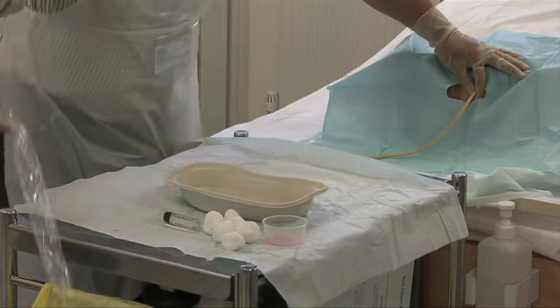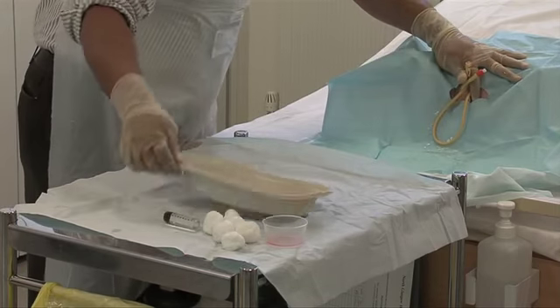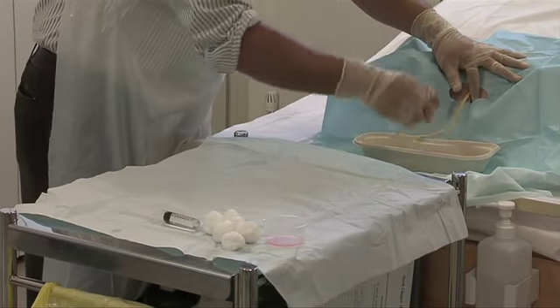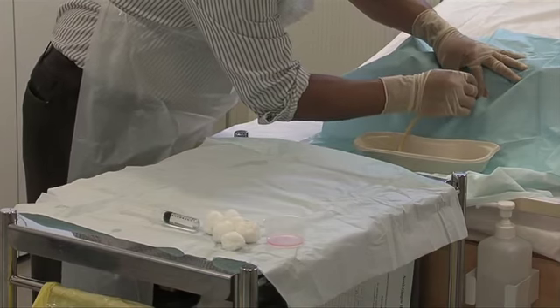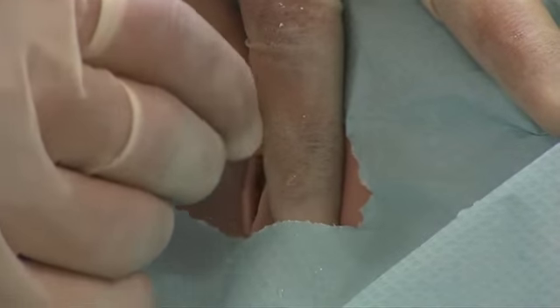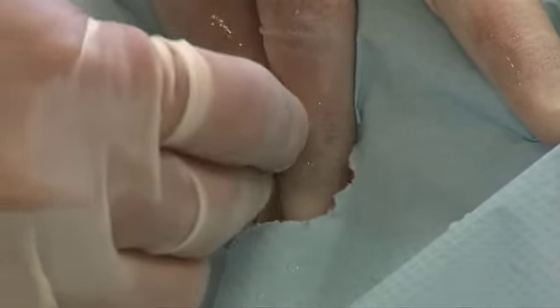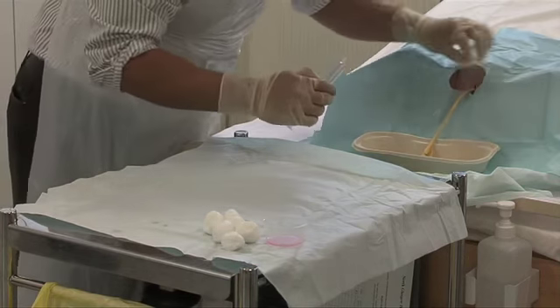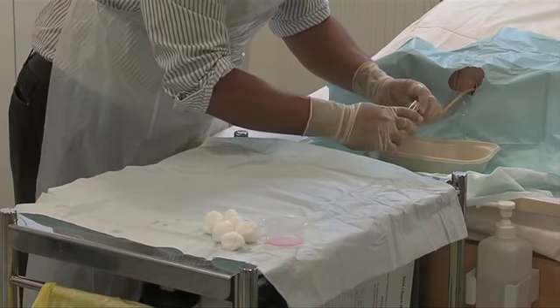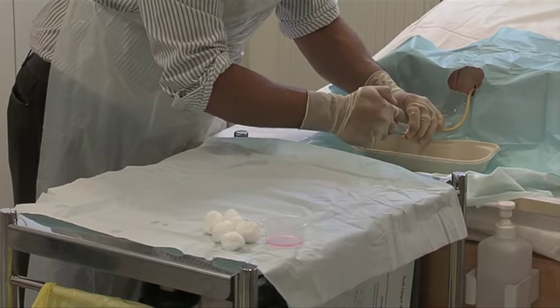Place a tray on the bed between the patient's thighs and place the distal end of the catheter in the tray. Slowly advance the catheter until 5 to 6 centimeters has been inserted. When urine begins to flow, advance the catheter a further 1 to 2 centimeters. Attach the syringe containing sterile water to the end of the catheter and inflate the balloon to secure the catheter in the bladder.